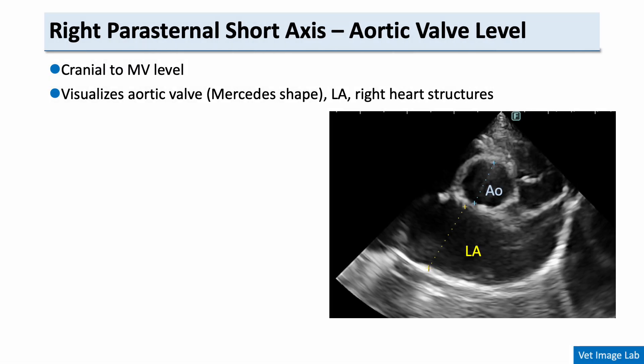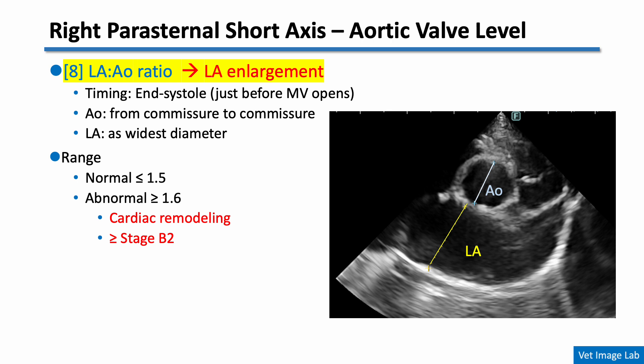Now let's move to the level of the aortic valve. This view is commonly used to assess the left atrium to aorta ratio, which is an important index for evaluating left atrial enlargement. At end-systole, the aortic diameter is measured from commissure to commissure, and the left atrial diameter is taken at its widest point. A ratio of 1.6 or higher suggests cardiac remodeling and supports a diagnosis of stage B2 or higher in MMVD patients.